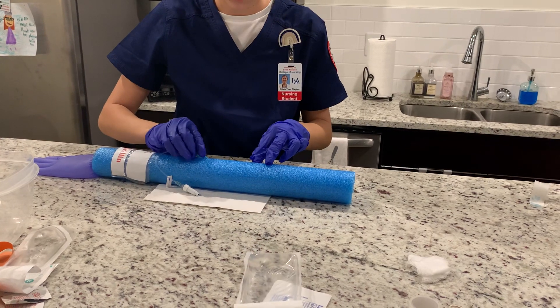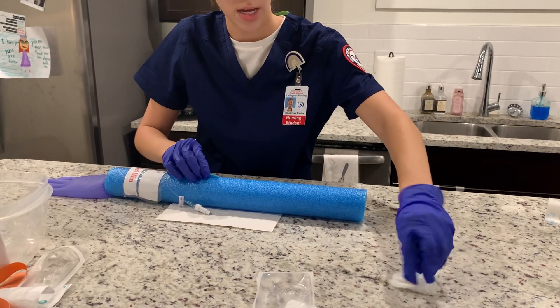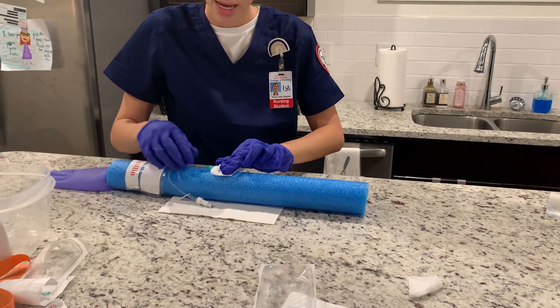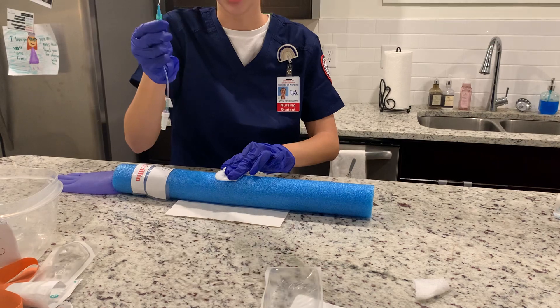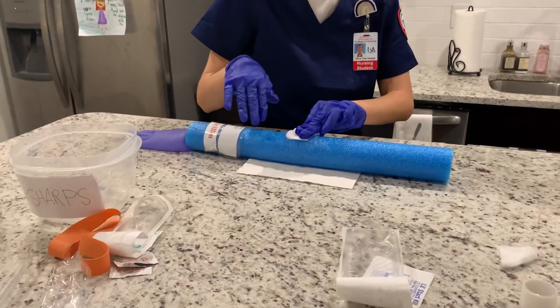I'm going to get a gauze, apply pressure, and gently remove the catheter, checking the intactness of the tip. I'm going to discard that and apply pressure for about 30 seconds.